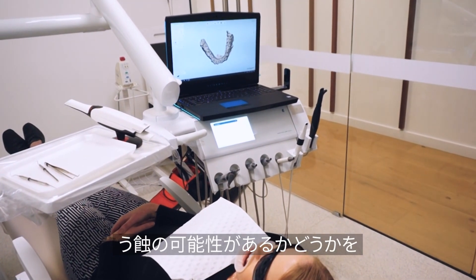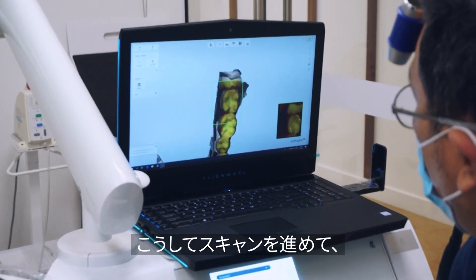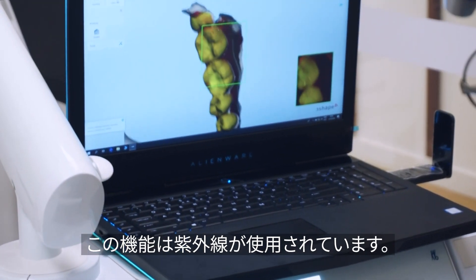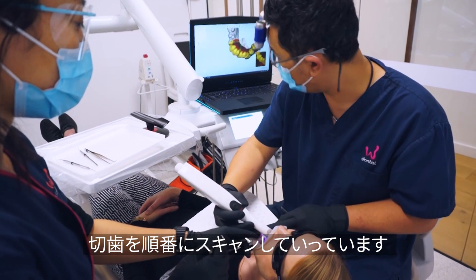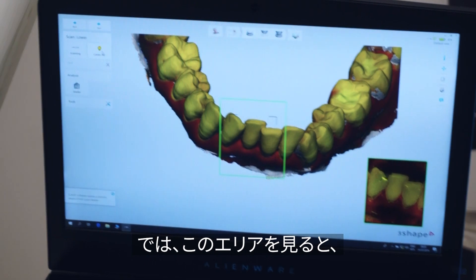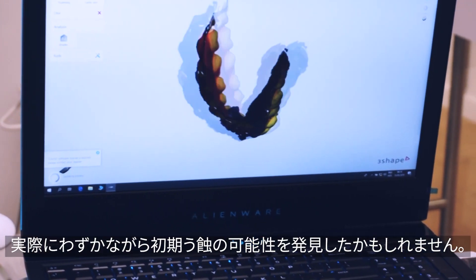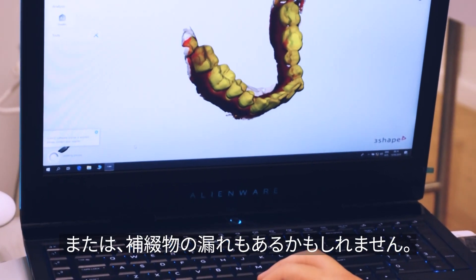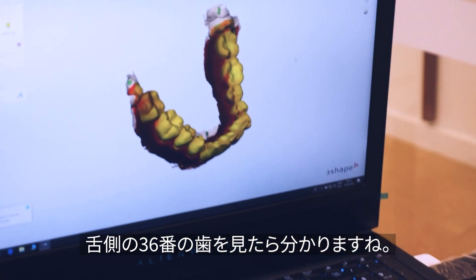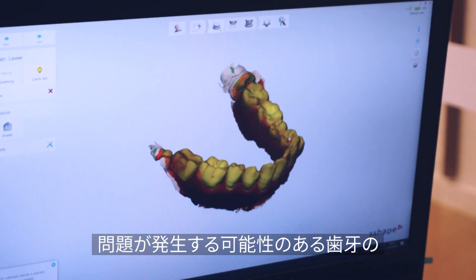We're basically going to see whether Naomi has any caries or not. Looking at this area, we may have actually found a little bit of early decay or leakage of a restoration — just there on the lingual of that tooth 36.